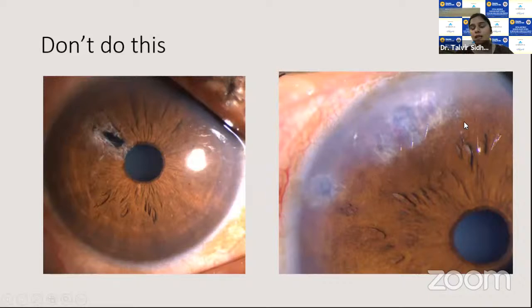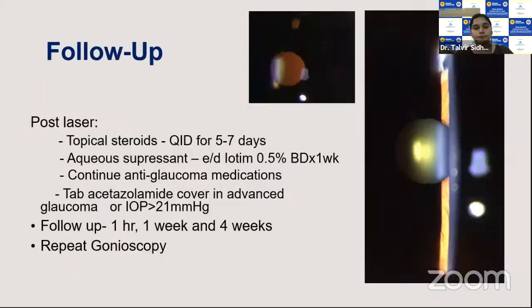And also sometimes people are very over enthusiastic. If they cannot do a PI in one area, they try in another area, they try adjacent areas. They would give 50, 100 shots in one setting and still the PI will not happen. Please do not give more than 5 shots and explain to the patient that the patient should come next time when the tissue has contracted enough, and then even a single shot would actually make your PI patent.